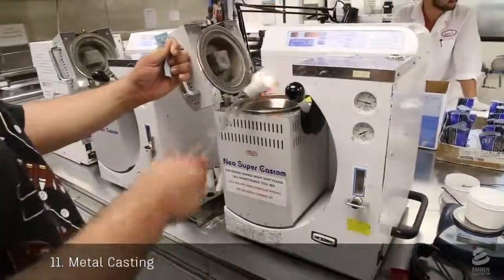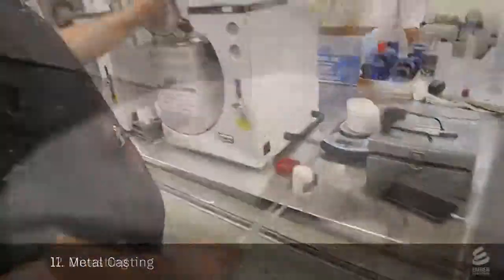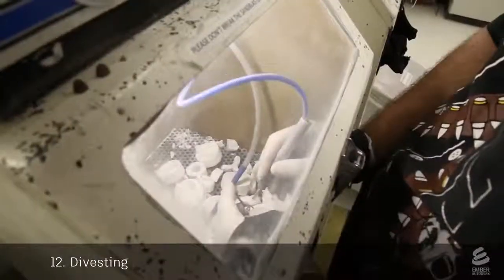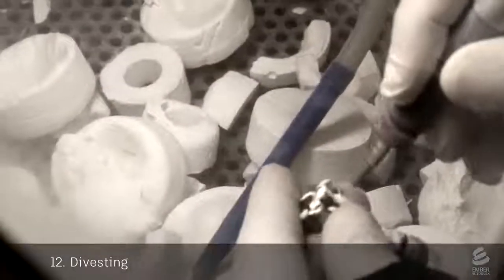The casting is removed from the machine and left to cool. In a process called divesting, a technician breaks apart the investment with a hammer and uses an air gun to remove any remaining pieces of investment.